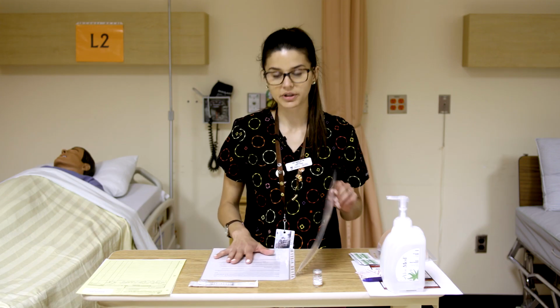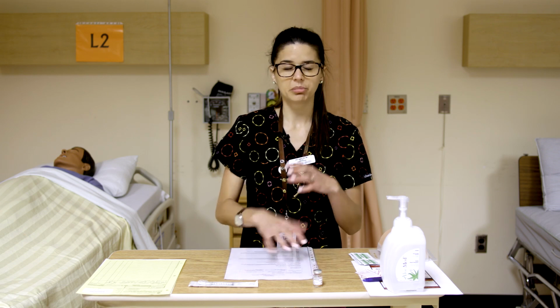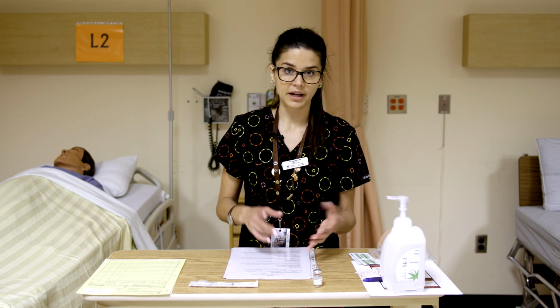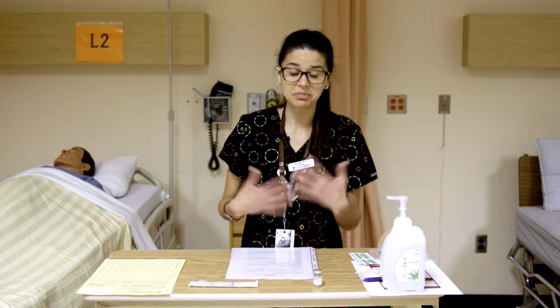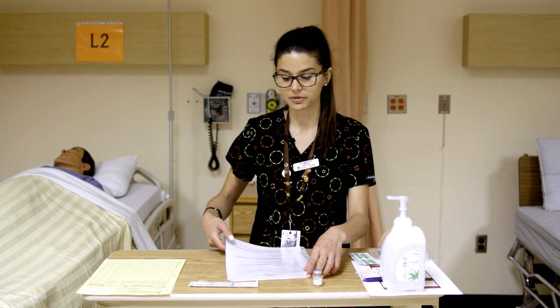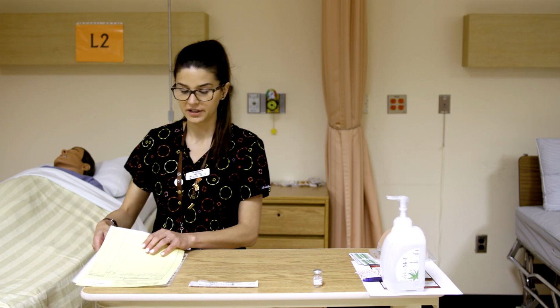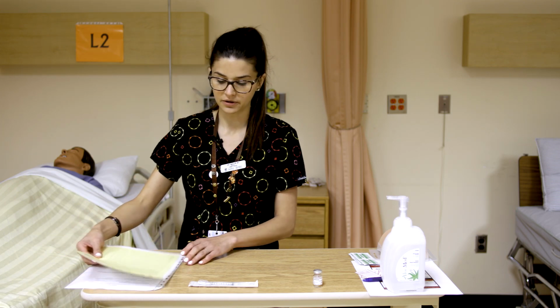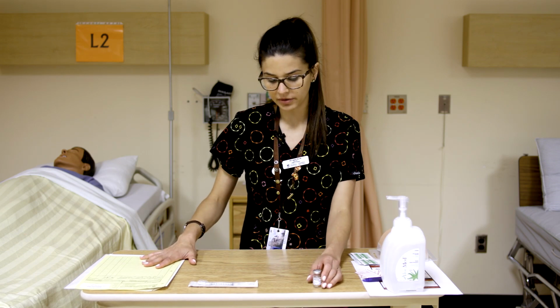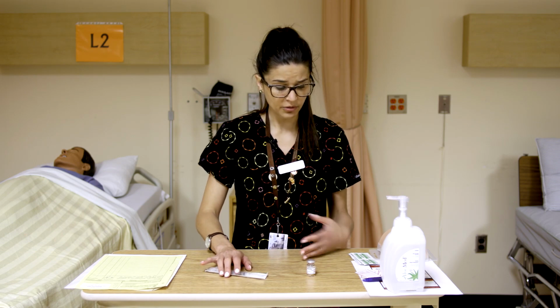So always you want to look up that medication in the parenteral drug monograph prior to preparing it, because if you go ahead and prepare, A, you haven't looked at the recipe, and B, maybe it can't be given via that route that you just spent time setting up. So good to look at first, and then ensure that it can in fact be given via that route, and that you have the correct instructions for preparing it. So we've confirmed now that this Tubersol can be given via the ID route. The next step will be to prepare it.